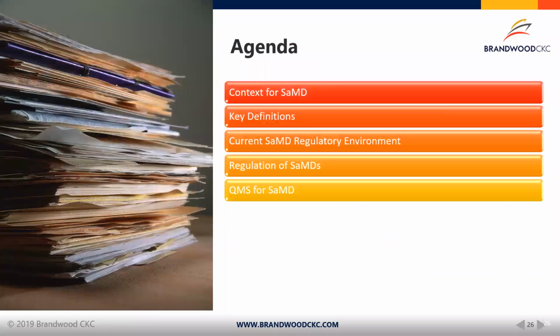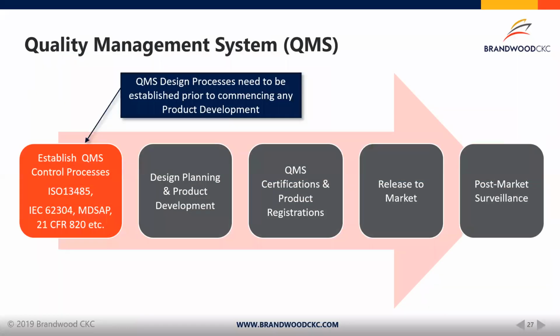So I'll hand over again back to Yervant to talk about quality management systems for software as medical devices. Thank you, Jean. Quality management systems are required by all regulators for the development, maintenance, and post-market activities related to software as a medical device.